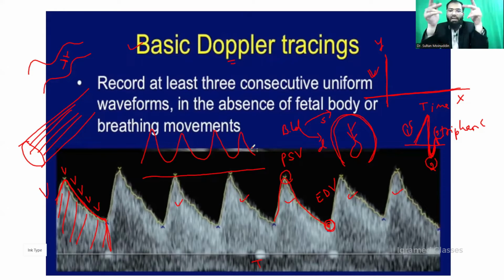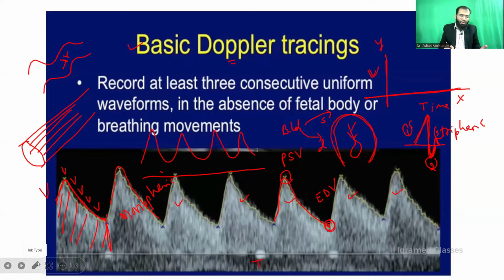Okay. Similarly, the umbilical artery has got just a single wave. Just see this one wave. There is no negative wave which is going. So that means the normal umbilical artery flow is monophasic. Monophasic. Very, very important. Monophasic. Okay. So this is the concept of monophasic. Just to show you, how would a biphasic waveform look like? So I'll draw here a biphasic waveform for you. Wait a minute. What we'll do is we'll rub this for you.